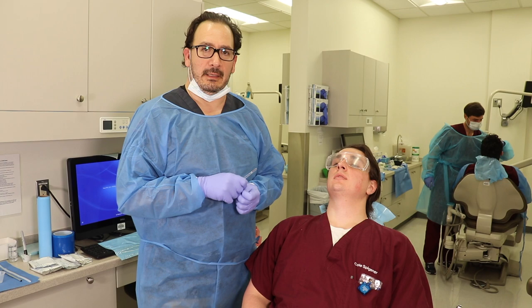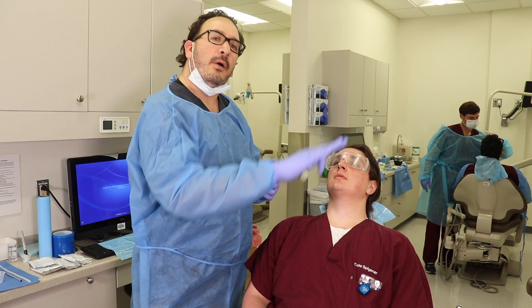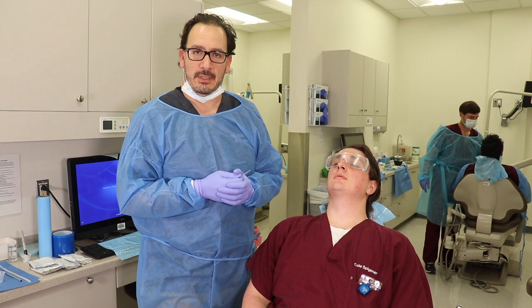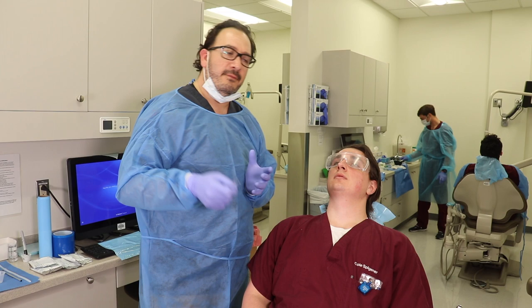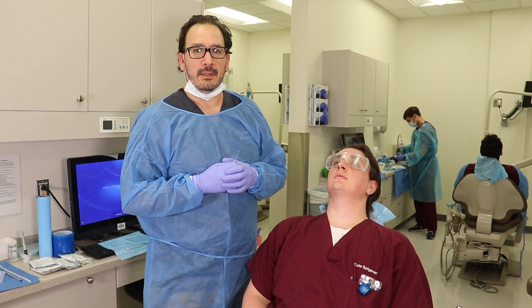Sometimes when we have bridges, alginate will flow under the pontic side, and we may get that impression locked. Also, some patients have lingual tori or maxillary tori, bony protrusions, that will prevent seating that tray all the way down, or can lock down that tray, okay? So once we check, open up for me, sir, thank you.